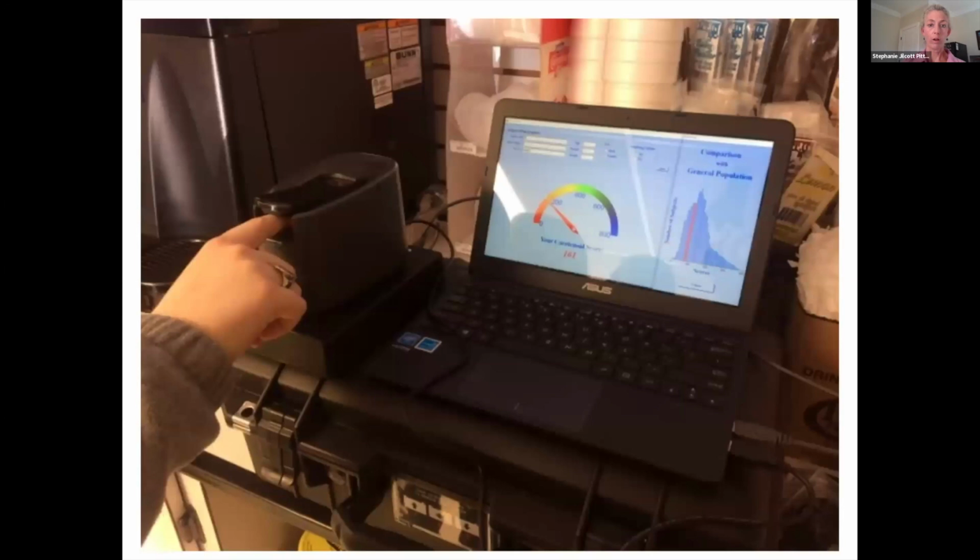Here's a photo from one of our research associates who, sometimes we jokingly say, this person really needs to increase their intake. We don't know exactly what a score of 161 means, but we know it's probably not that great. We'd like it to be a little more in the green to blue zone on that little Veggie meter.